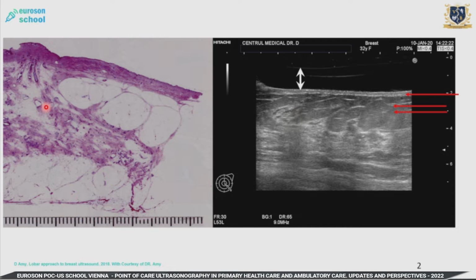You have to think that breast is an orange with up to 15 lobes each. It doesn't matter if you have 12, 10 or 15. We are not able, never ever, to say how many we have. We have to think from the anatomic point of view because we are clinicians. And this is the lobe. It's the epithelial structure, as you heard yesterday. Then you have the fatty tissue below the lobe, the glandular structure, which is here.